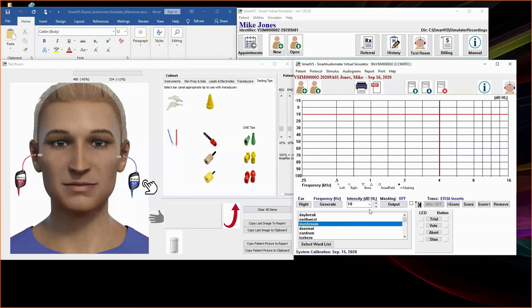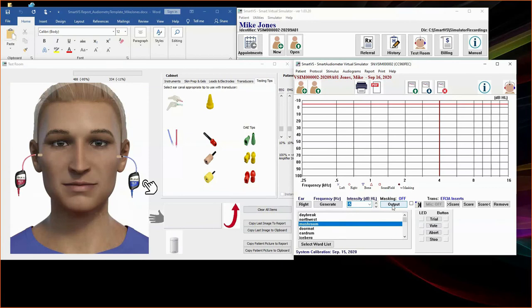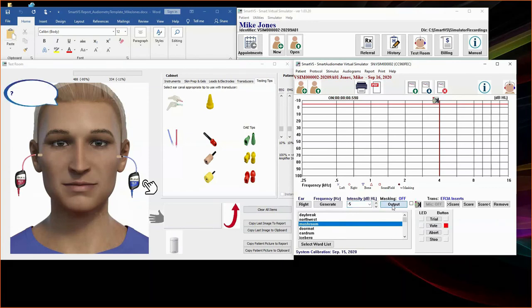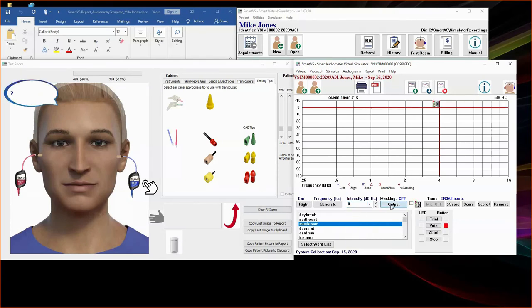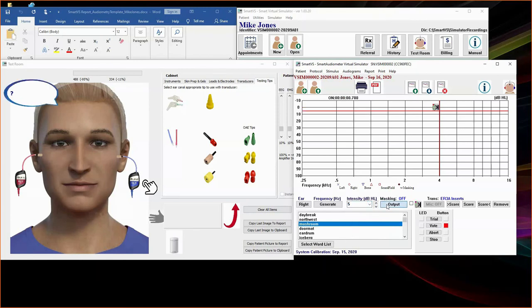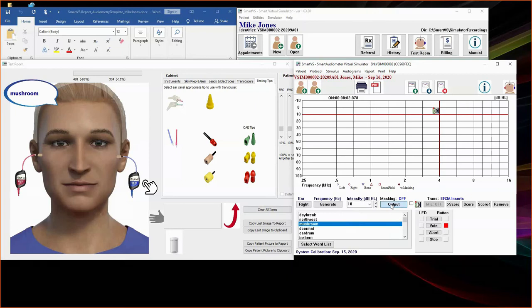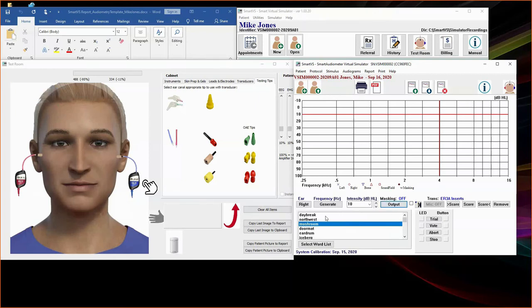So let's go to a second Spondee. Go down to minus 5 to begin the threshold search. We output. Patient does not understand the word. Go to 0. Patient does not understand the word. And 5. Patient does not understand the word. 10. Patient understands the word. So now we have reached the criteria of two Spondees correctly identified. They were both identified at 10 dB. So the SRT for the right ear is 10 dB. And you would repeat the same for the left ear.